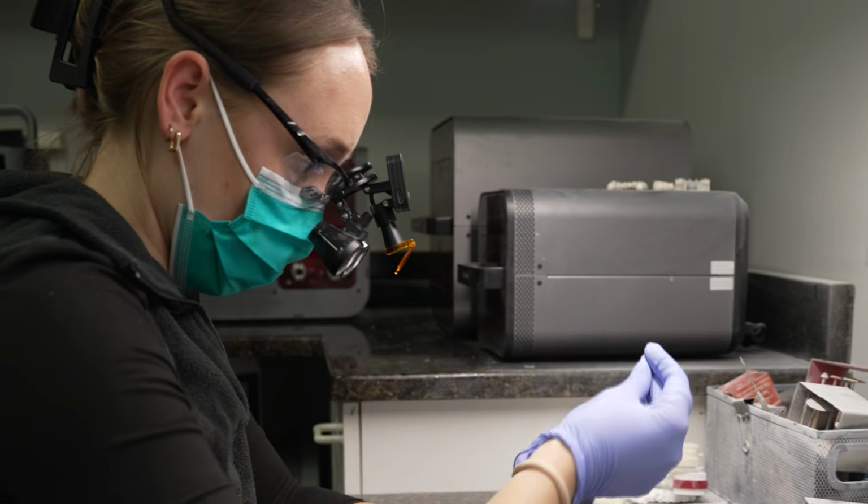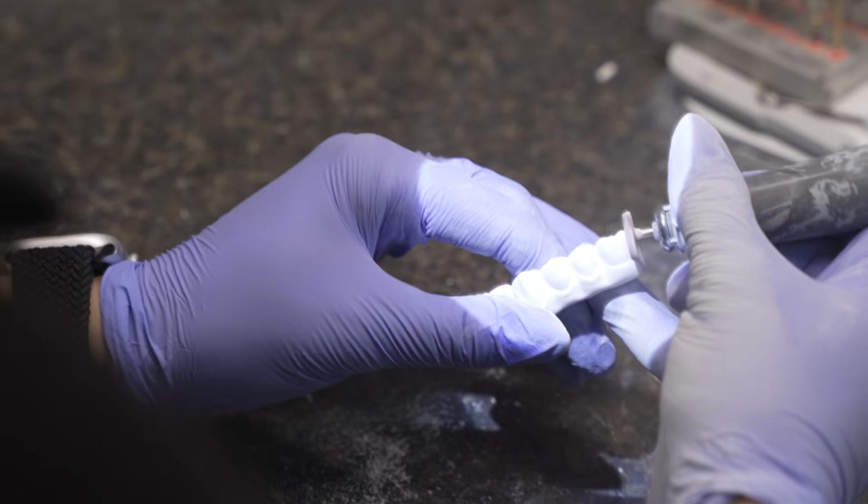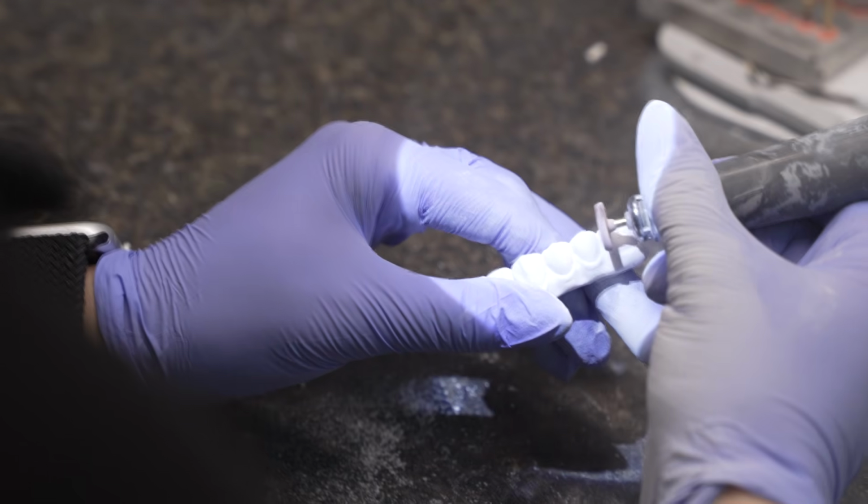The other benefit of a dental assistant is it allows you to keep people, it allows you to expand people. They learn new things, they learn new skill sets. The same dental assistant that's assisting me chairside, they've seen the tooth shade, they've seen the patient, they've listened to the patient, they've heard what the patient wants, and now when they go to actually fabricate everything, that's right here. That level of communication that happens right there, that's the real advantage from a predictability and an outcomes perspective, being able to do it right then and there.